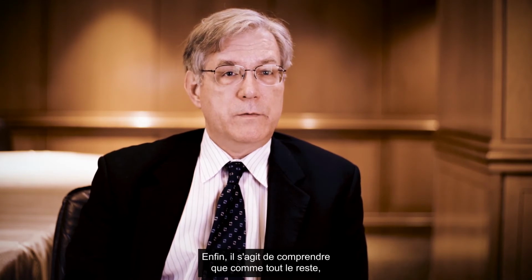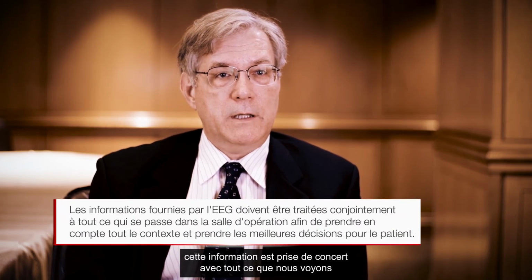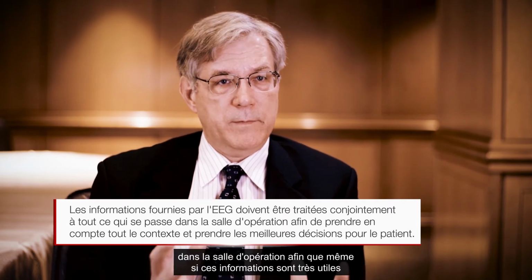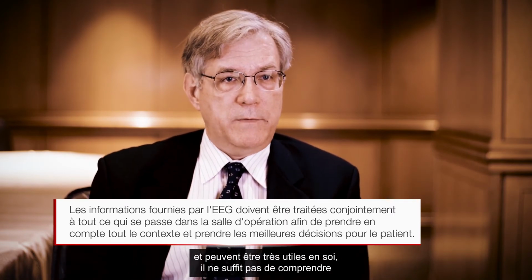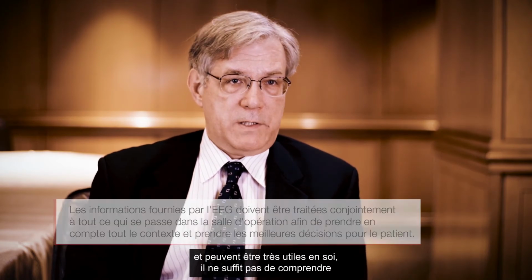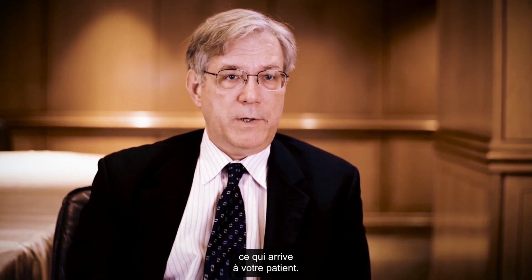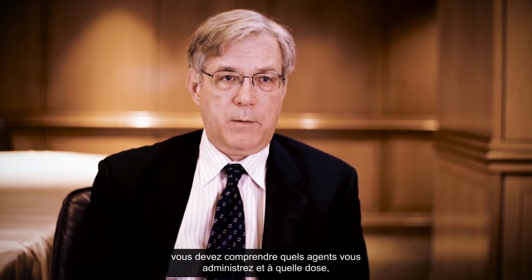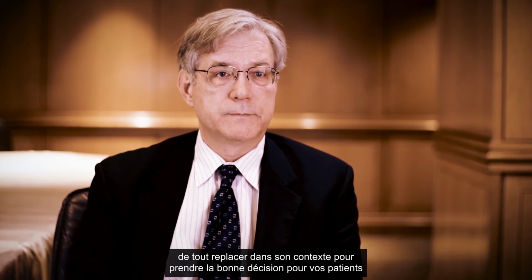And finally, it's to understand that, like everything else, this information is taken in concert with everything else that we're seeing in the operating room. So even though this information is very useful and can be very helpful, in and of itself, it's not enough to understand what's happening to your patient. You need your other monitors, you need to understand what agents you're giving and how much you're giving to put everything in context to make the right decisions for your patients.